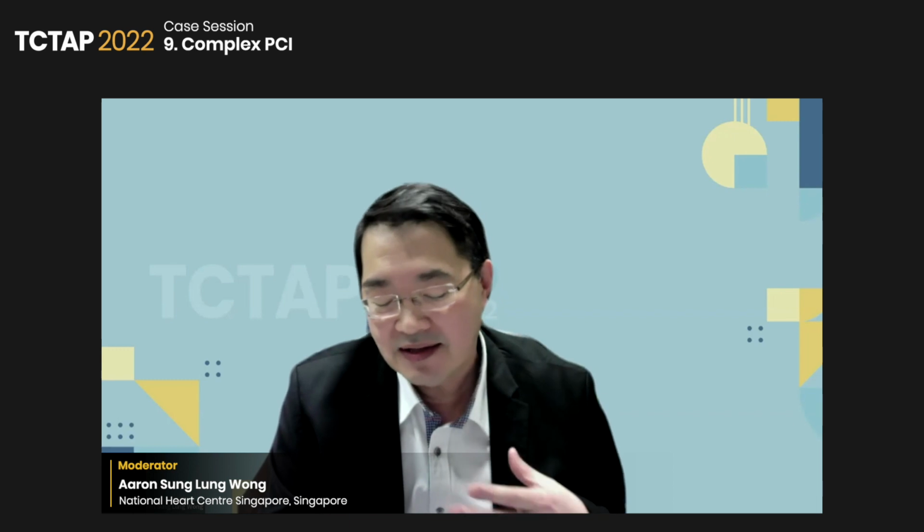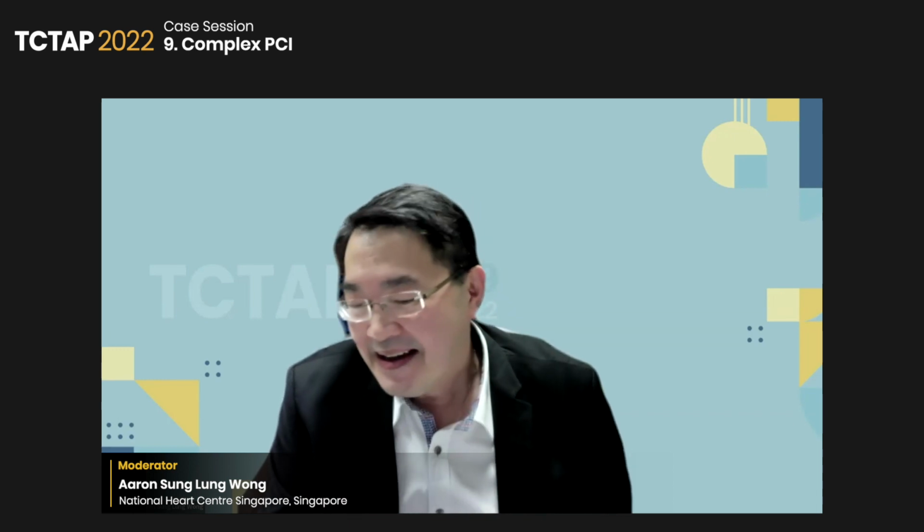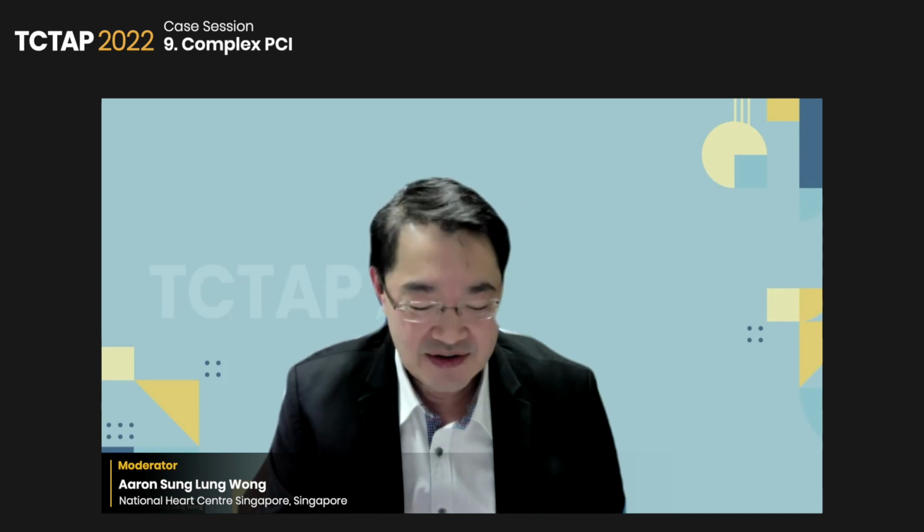I would not have ignored this ramus. The answer to your question is I would not have ignored this ramus. I would have kept a wire in that ramus. Try to preserve it. Yeah, of course, we would try to put a wire to protect it, but provisional means that you don't do a kissing. That's the definition of provisional. Yeah. Anyway, the final result is excellent.